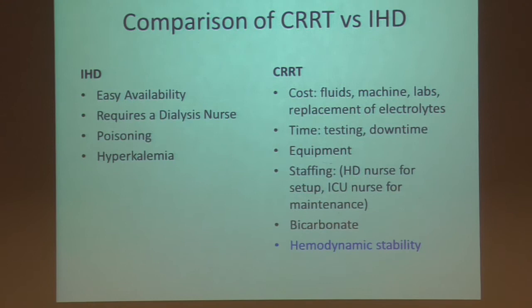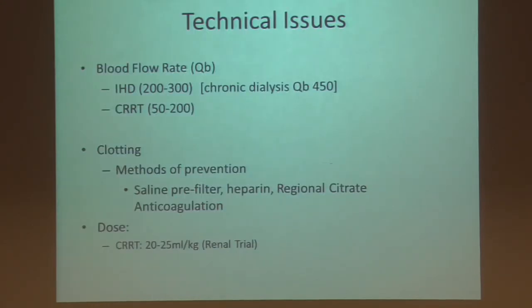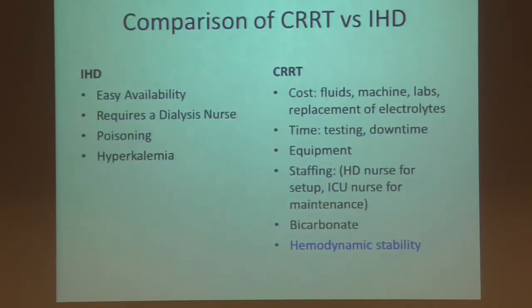So this net dose of CRRT fluid is the effluent. And what this means, you'll see this written everywhere, is the amount of fluid we gave plus the amount of fluid we take off. That's considered the effluent. So that's why you don't always have to run it that high, but we always run around 30 ml per kilo, or I used to when I used these machines, because you always have to factor in downtime, radiology, surgery. Patients aren't going to be on dialysis the entire day, right? So you always want to run a little bit higher to factor in for downtime.